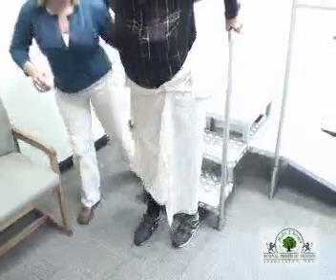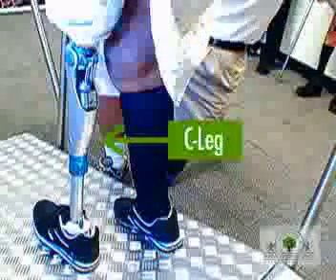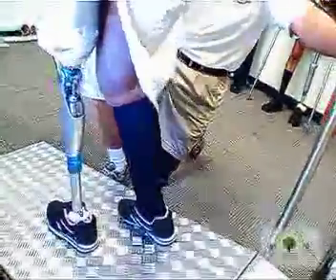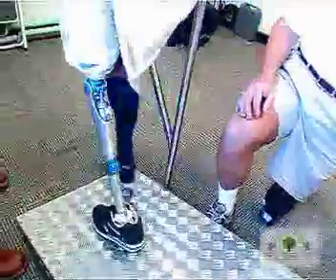I was just coming down a little bit in front of you. Step, there you go. Step, let's do that again. Whatever you're most comfortable with.